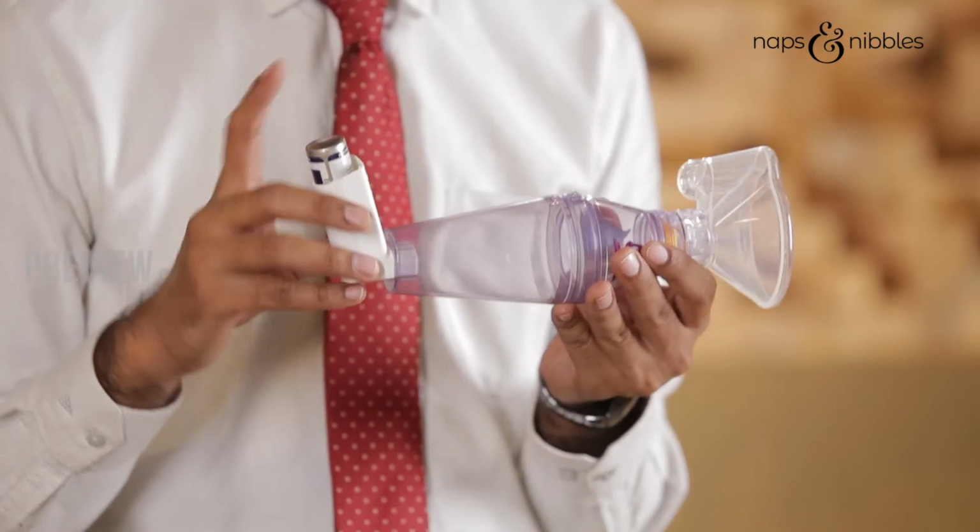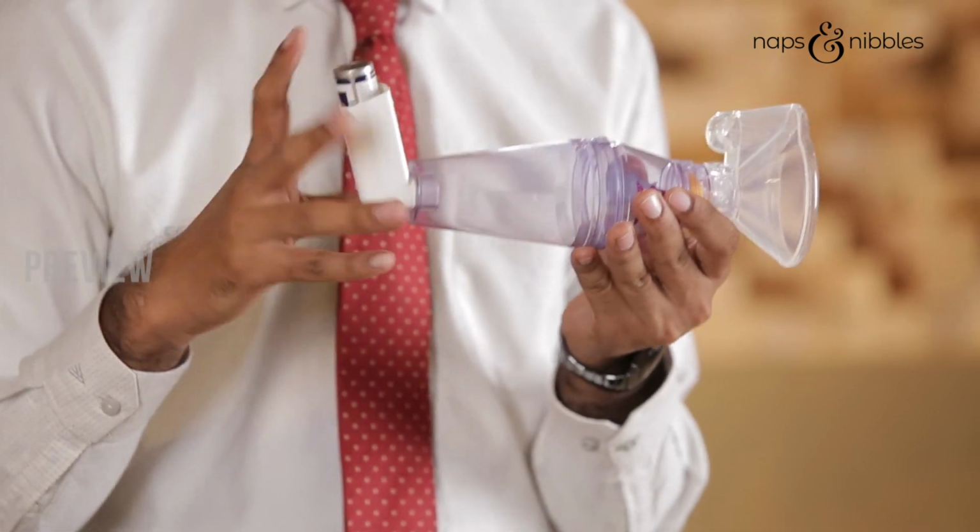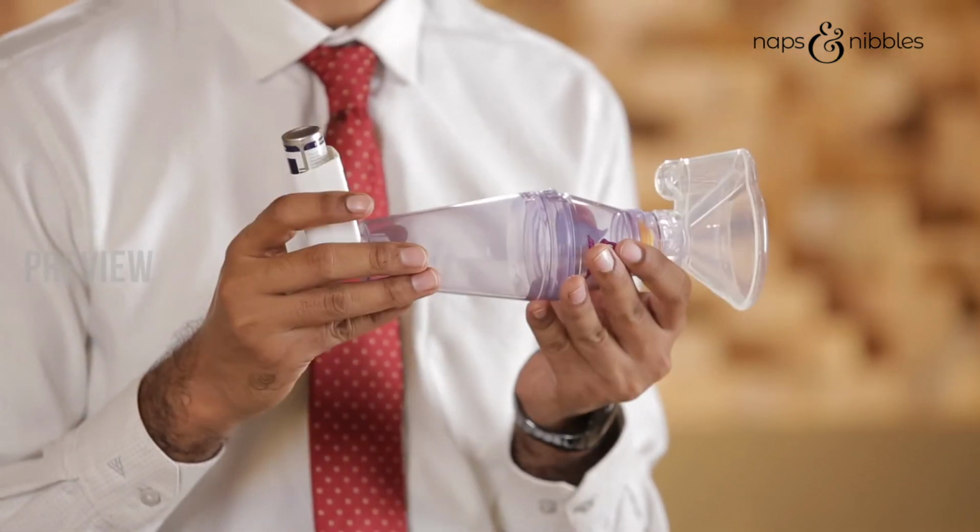So here, after you administer the puff, you only need to hold the spacer and the mask to the face of a child for around 1 minute and let the child breathe regularly. You can ask your child to take deep breaths, but if he or she doesn't do it, do not worry. Just regular breathing through the mask for around a minute will ensure that the medication will go in.